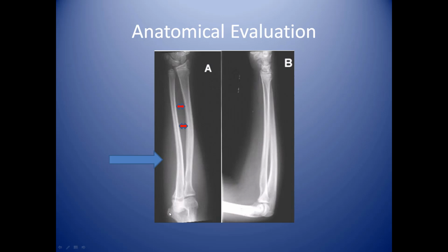The elbow joint down here is slightly rotated. It's not as true AP as the wrist was, but you can see the olecranon of the ulna coming into the humerus, and you can see your funny bone, or the 2 condyles, kind of off in profile. So this will help identify that you've got a good AP. Also, in the AP, you've got a good gap that separates the two of them between the joint spaces.